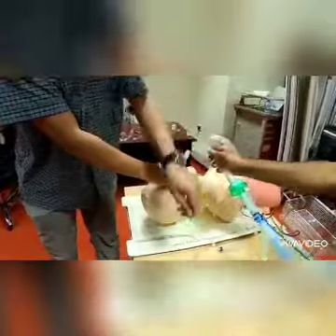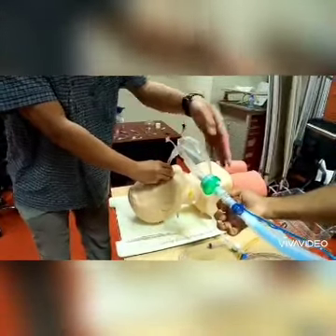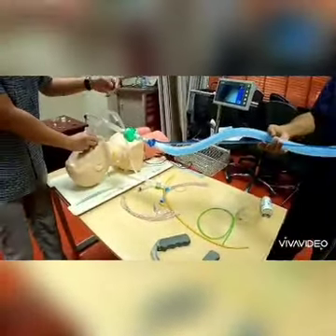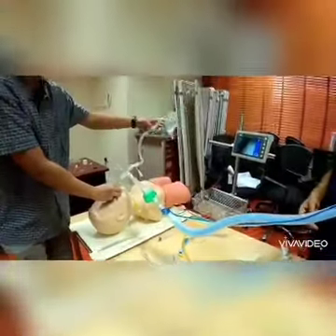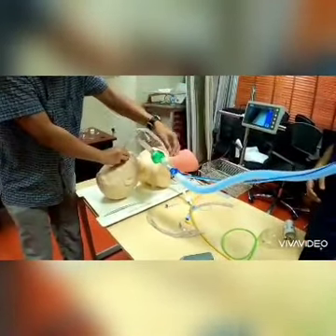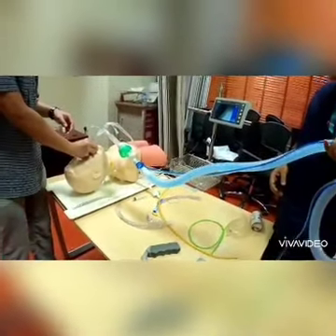I'll remove the stylet and immediately attach to a ventilator circuit, which I have already pre-prepared before I start the RSI, which has the closed suction circuit and also an HME viral filter attached, together with an end-tidal CO2 to the ventilator circuit.